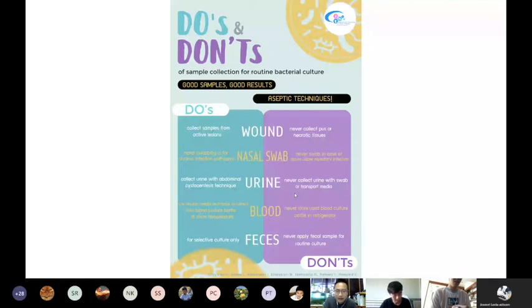If the number cannot be interpreted as significant bacteriuria or significant urinary tract infection, we will not continue to isolation or identification. That's why we should have the urine itself, not a swab, because with a swab we cannot use it for counting. You understand me? Okay, thank you, Peter.